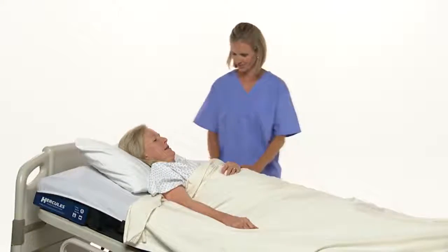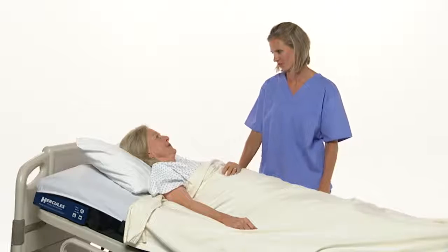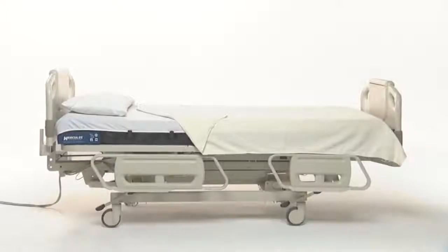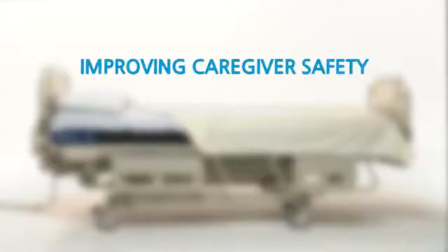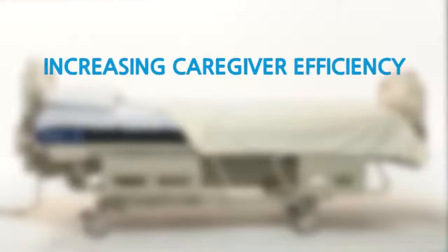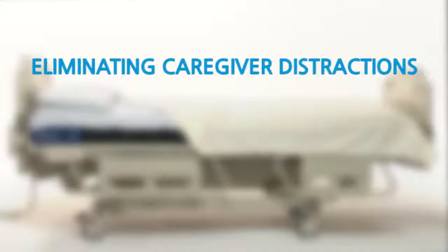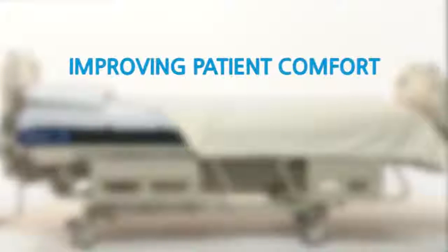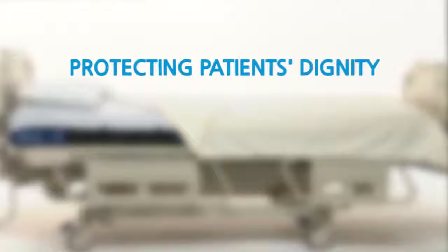And since only one person is needed to reposition the patient, caregivers have more time for value-added nursing activities. The Hercules Patient Repositioner: improving caregiver safety, increasing caregiver efficiency, eliminating caregiver distractions, improving patient comfort, and most important, protecting the patient's dignity.